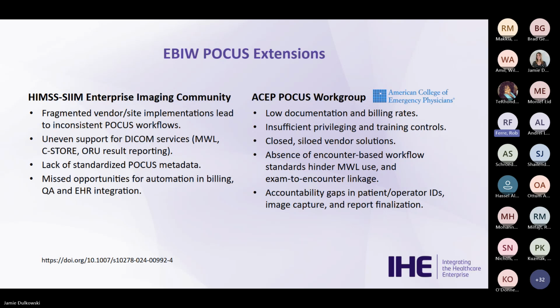From the clinical standpoint, representing the American College of Emergency Physicians, as physicians, this impacted us in many ways because while we were using ultrasound, we really weren't able to document it.